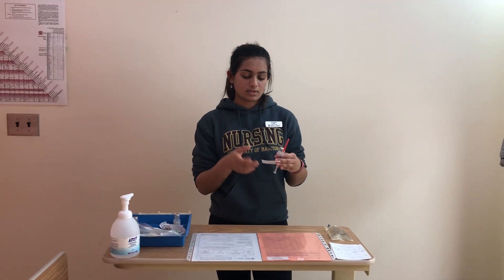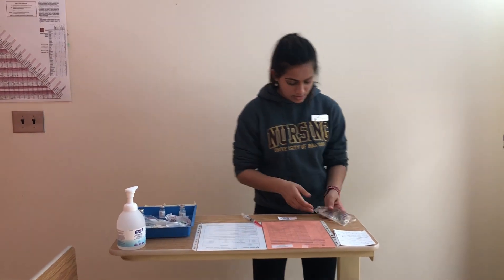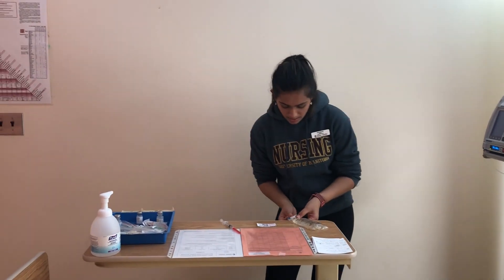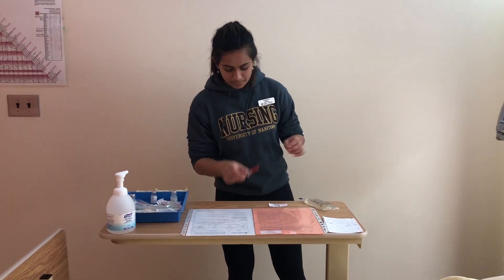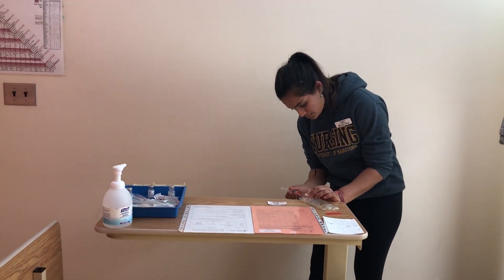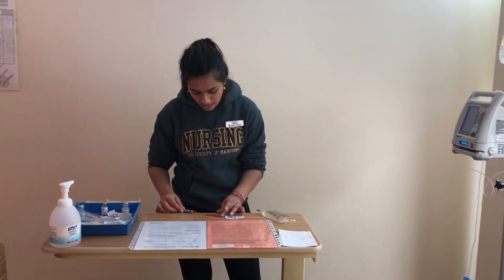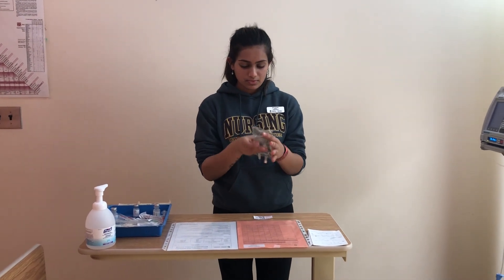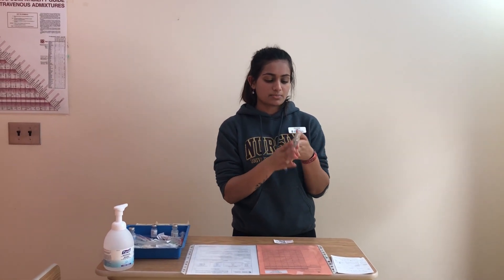I'm going to get another alcohol swab and swab the port of the mini bag for 30 seconds, let it dry for 15. Just confirming it's 1.2 mL. The port has been swabbed, so I'm going to instill the medication, being careful not to perforate the bag. I would normally discard the syringe into the sharps container. I'm going to mix the medication, noting that the mini bag is not expired and was intact.